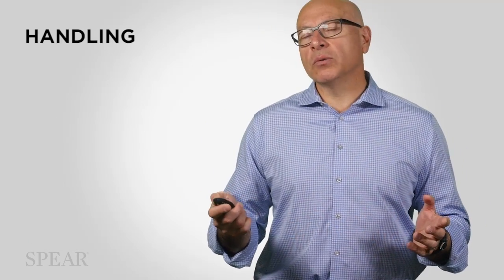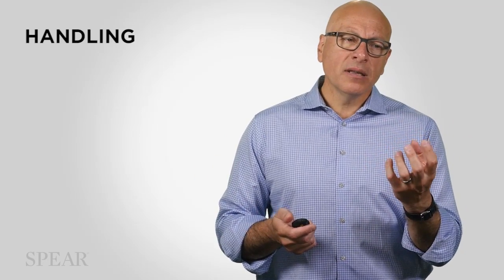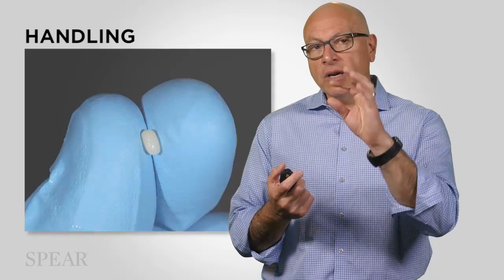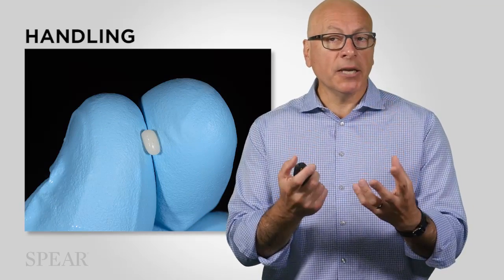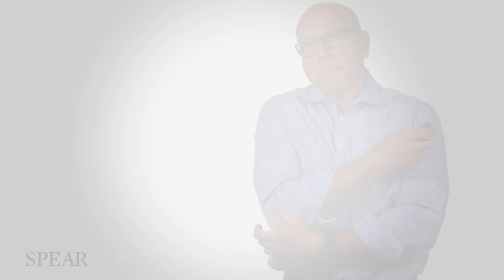Handling is also very important with materials. Some materials are sticky, runny. Some materials have what we call a waxy consistency. You can grab them with your fingers, you can shape them. They're not sticky. I particularly like materials that are not sticky, that I can shape in the mouth. So that's something that is different for everybody. Everybody likes different things, like different instruments, different consistencies. I particularly like the consistency of Filtek Supreme Ultra, the one that I used at school. It's very nice for me.